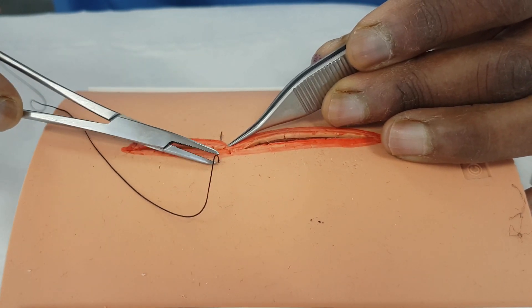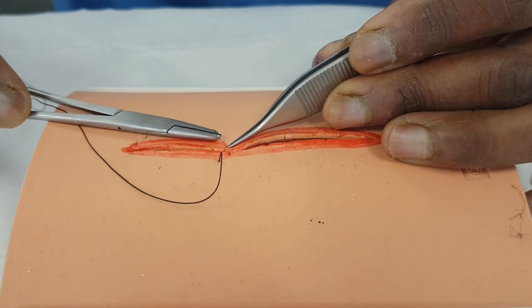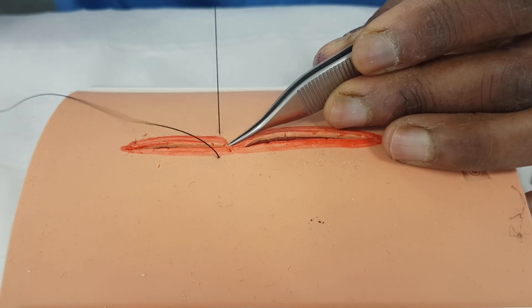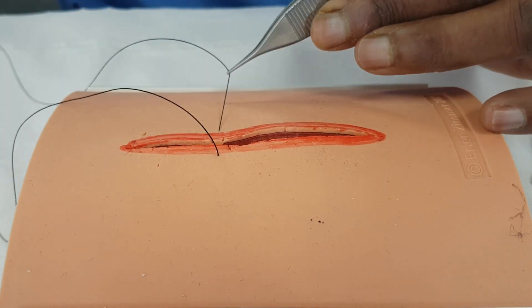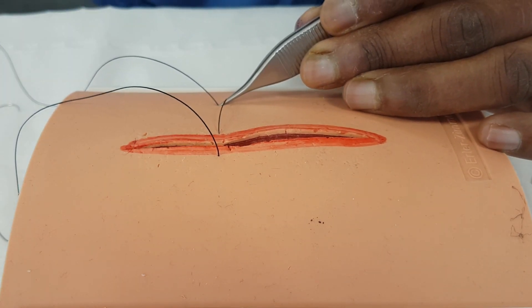As that comes through, you push it through, and you have to be careful to avoid the tip of the needle when you're picking it up with your needle holder, because you don't want to squash that. We've got a very long stitch in here, so I'm going to make life easier by cutting part of that stitch away, because we don't need it all.